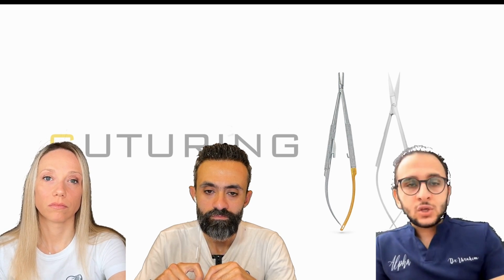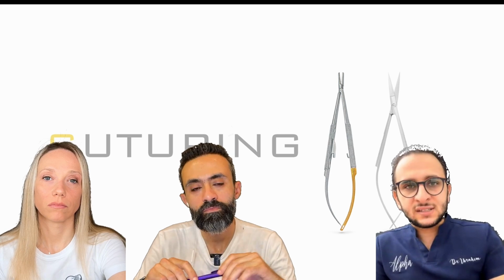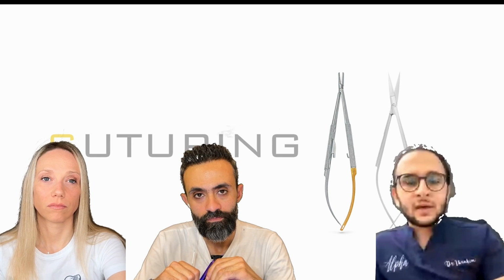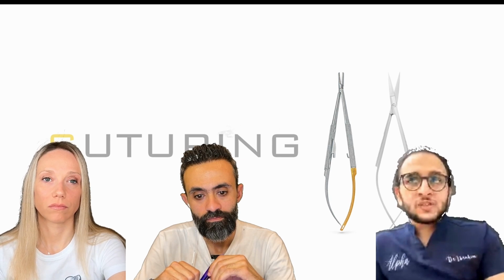And after cleaning and finalizing everything, now we have to go for suturing. And when I talk about suturing, I have to say it's microsuturing, because I don't remember one time I sutured a patient in a microsurgery using a 4-0 or a 3-0. The minimum start nowadays is like 5-0, and we are going up till now to 6-0. Because the smaller the suture is, the better the healing and the less the scar.